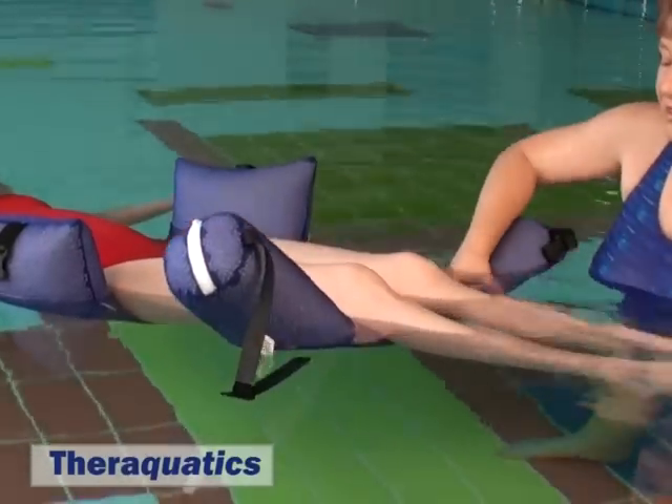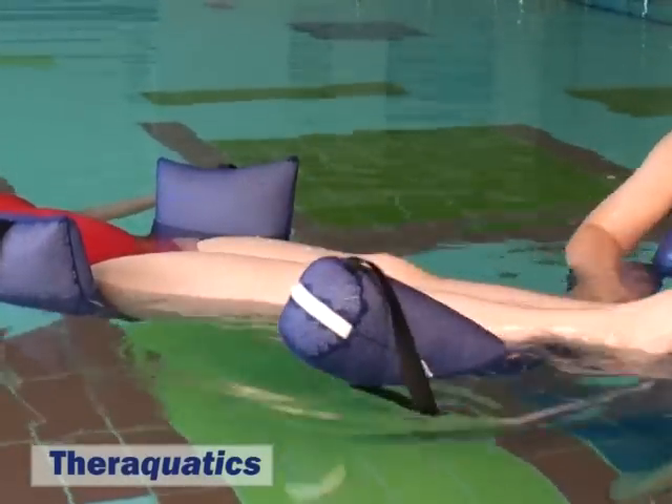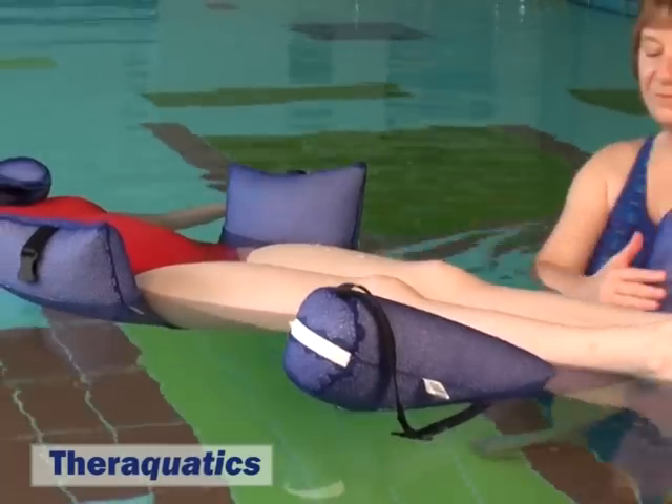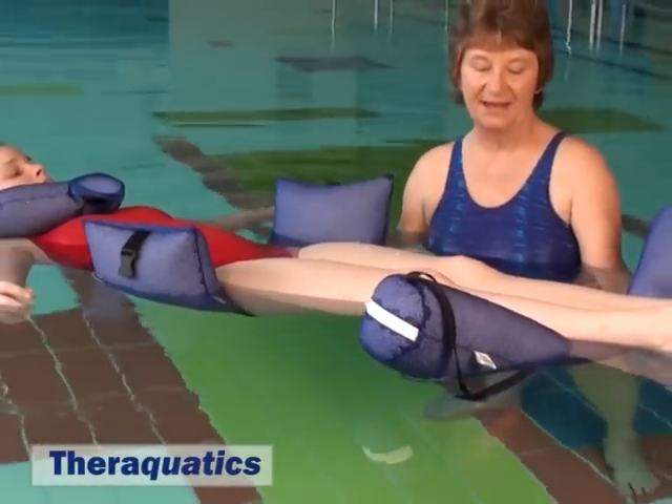However, some people may require their knees to be straight and it could be put under the ankles. Ensure this doesn't give too much strain on the legs and the back though.